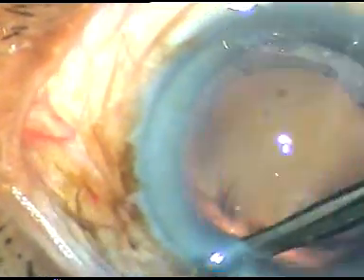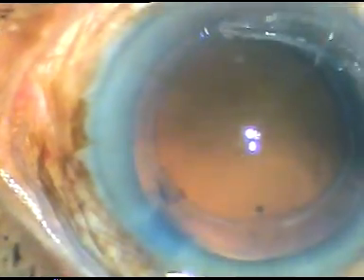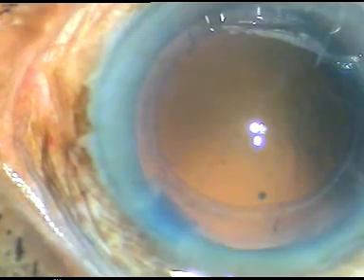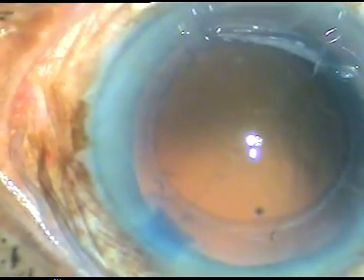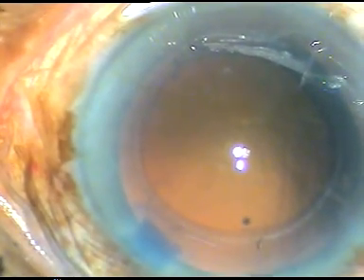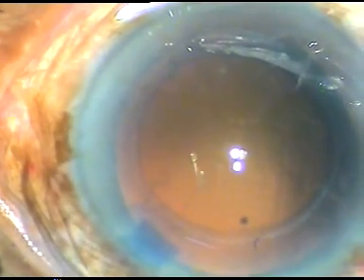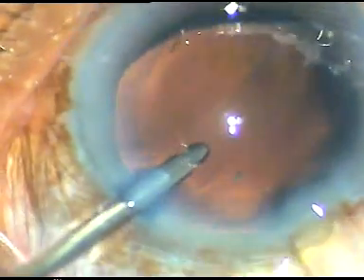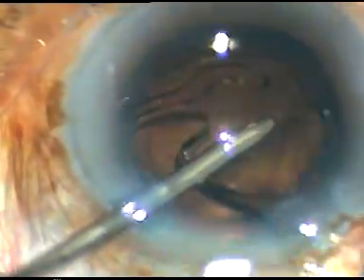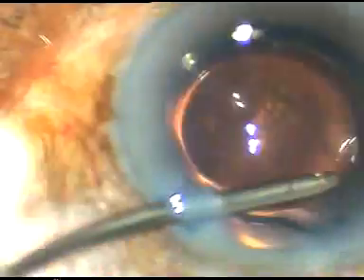Now in this case I have selected a hydrophilic acrylic intraocular lens, and I have planned to implant the lens under irrigation. Irrigation will keep the anterior chamber formed, and I will implant the lens in the capsular bag. Here it is. Irrigation through the left side port, and here goes the lens. The leading haptic has gone into the capsular bag, and the trailing haptic has also gone into the capsular bag.